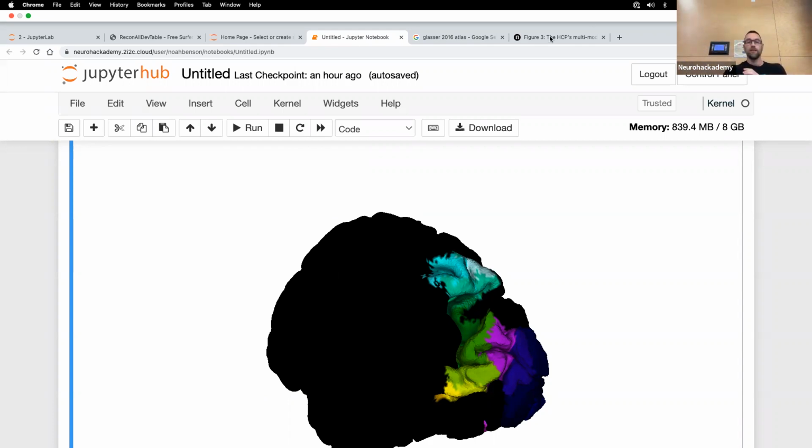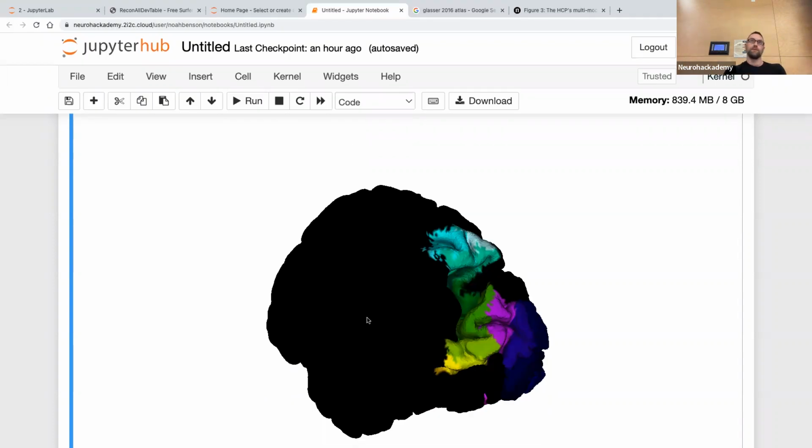And that is FreeSurfer's individual subject native space. What fMRIPrep does is interpolate all of your bold data onto the surface for you, so you don't have to worry about that. And then you just take individual vertices and solve the GLM for vertices. Additionally, there's FS average space, which is the same thing, except instead of interpolating onto your subject's vertices, they interpolate onto the FS average vertices after alignment.